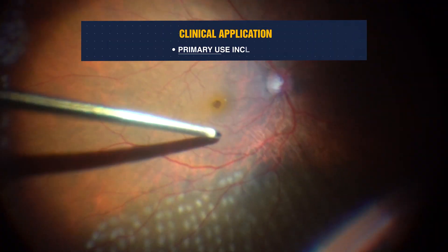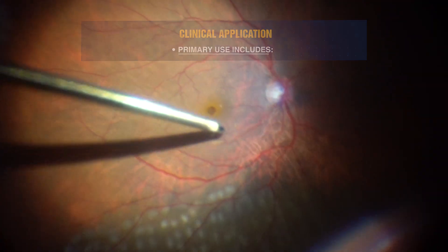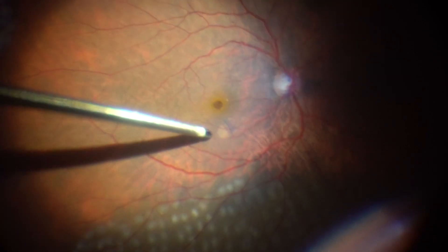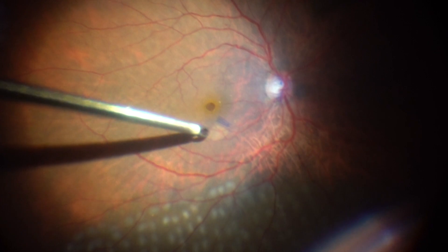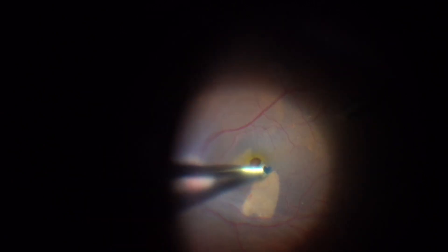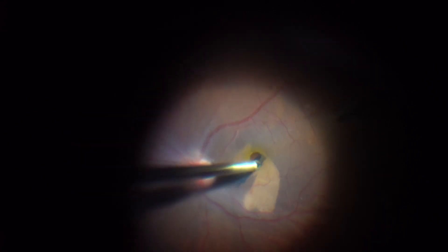The primary use of this instrument includes: the Dhamis ILM forceps allows scraping the ILM and epiretinal membranes from the retinal surface by gently grazing the tip with the stained ILM. The diamond dusted tip allows easier friction with the stained ILM to obtain a lifted edge of ILM, and simultaneously grasping the ILM to close the macular hole.